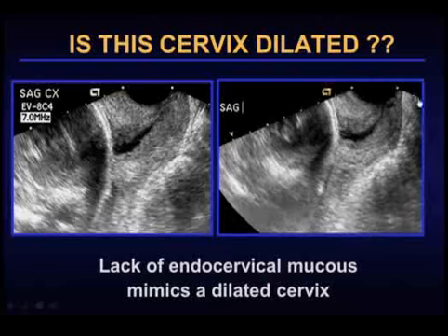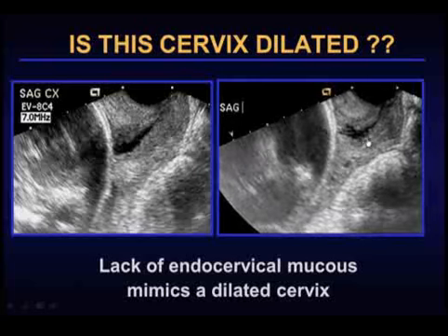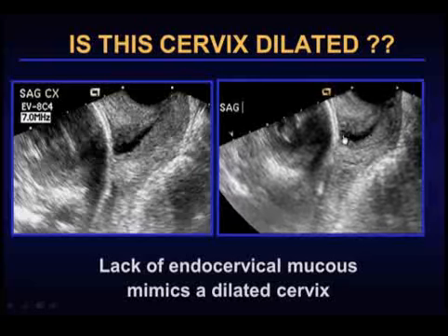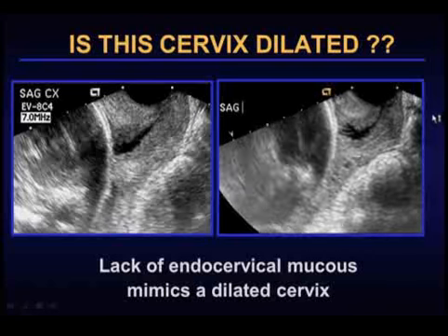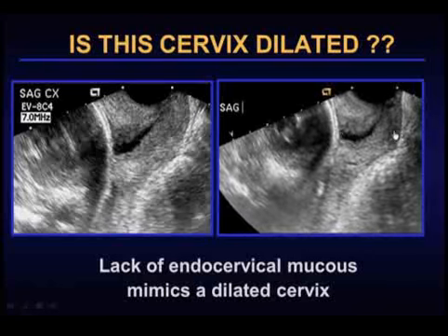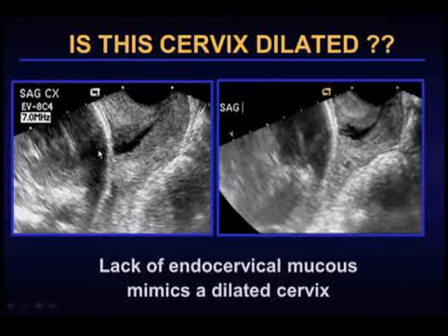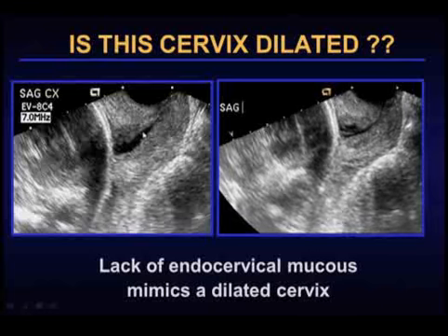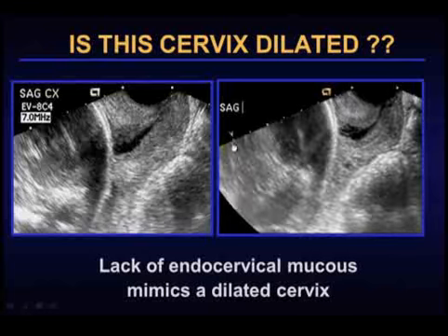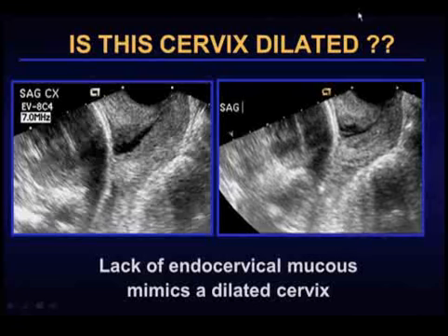But in point of fact, if you look at the clip carefully, that's a little white line here that you're seeing, which is actually the opposing walls of the cervix. That's actually the endocervical canal. And so therefore there's not fluid, but most people have more echogenic mucosa of their cervix. So in this case, for whatever reason, I don't know, the echogenic endocervical mucosa is lacking.